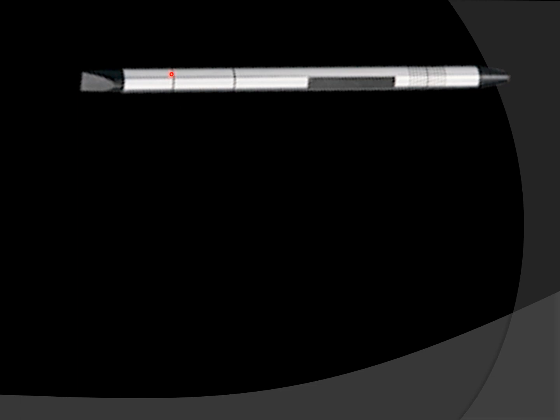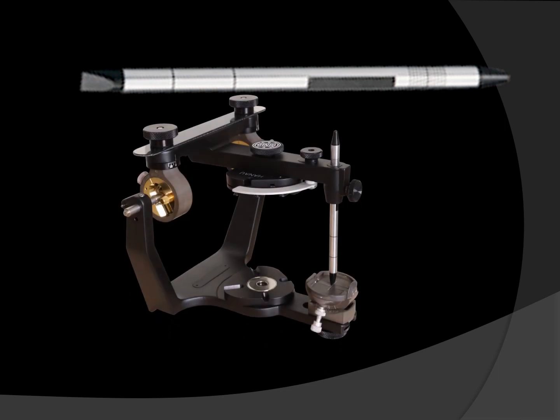Now, this 37 mm line is actually based on Bonwill's theory and results in a generally horizontal appearing plane of occlusion, whereas the 54 mm line forms an average landmark for the alignment of the incisal edge of the upper centrals when making a facebow transfer. Now, while the incisal guide pin is placed, you can see it extends beyond the tip of the upper member. So this is to provide a third point of stability when inverting the articulator for mandibular cast mounting. So this acts as a stability point. So this is about the incisal guide pin.